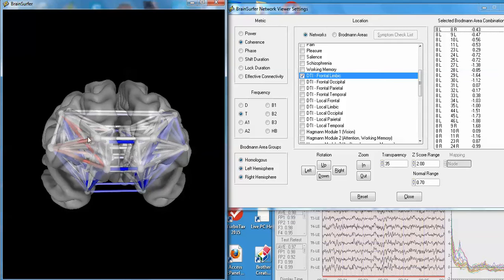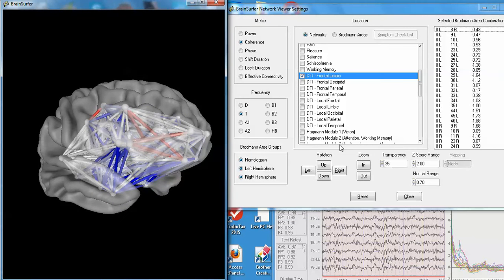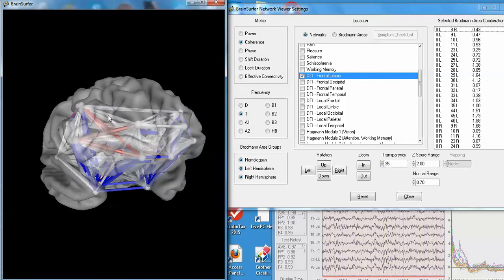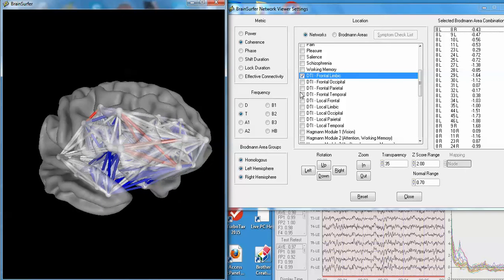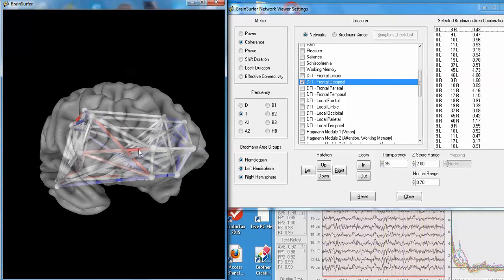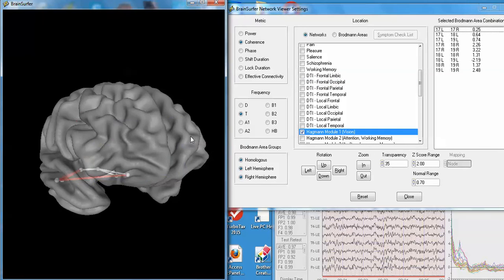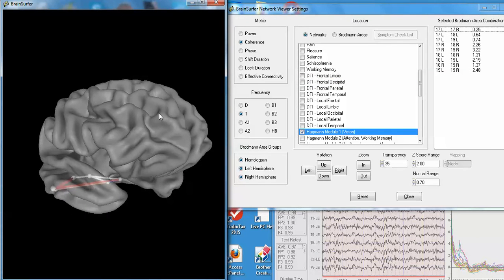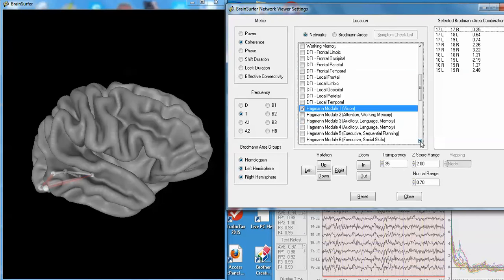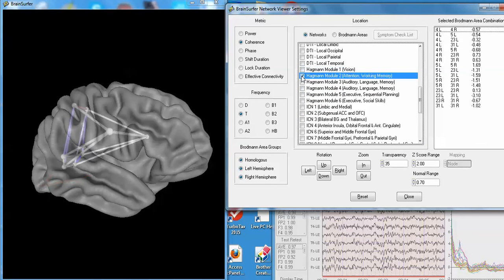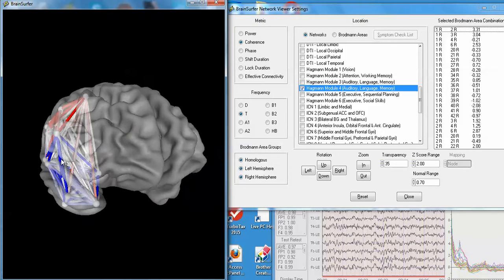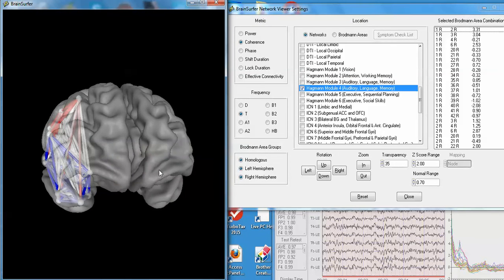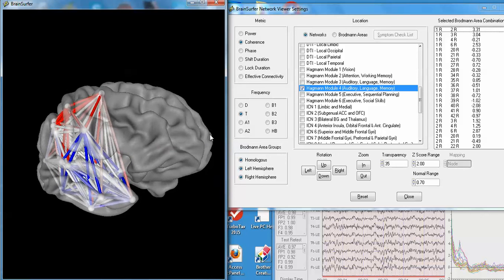This is from Catani and Thiebaut. That's the frontal limbic network, the frontal occipital network. Here's the Hagman hub 1. That's a hub that represents, there's only six hubs in the brain. Out of the 100 billion neurons, they cluster into six hubs. And here are the six Hagman hubs. You can explore them in detail. You can see the Hagman hub 4, which is primarily with auditory language and memory, on the right.